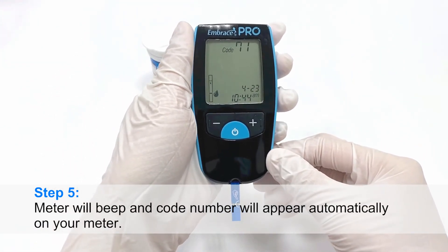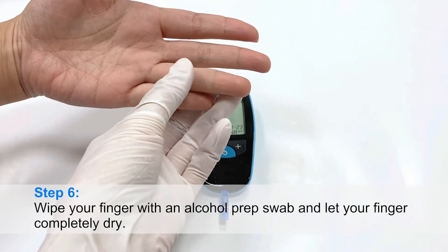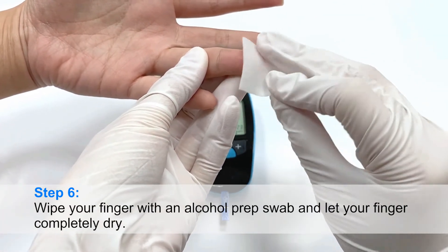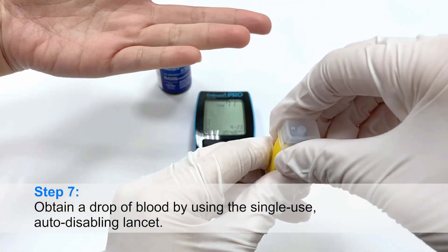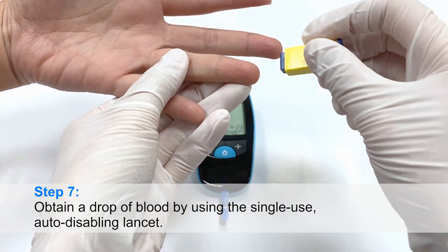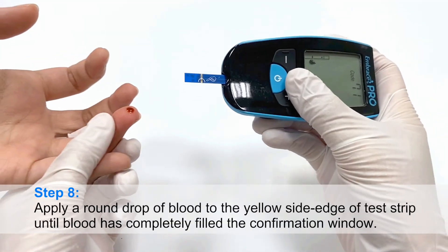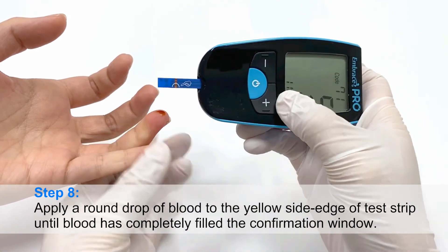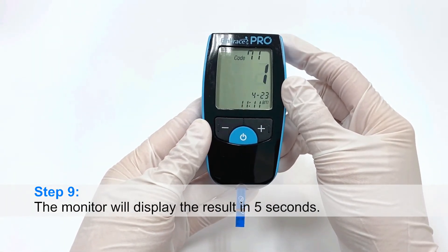Step 5: The meter will beep and the code number will appear automatically. Step 6: Wipe your finger with an alcohol prep swab and let your finger completely dry. Step 7: Obtain a drop of blood by using the single-use auto-disabling lancet. Step 8: Apply a round drop of blood to the yellow side edge of the test strip until blood has completely filled the confirmation window. Step 9: The monitor will display the result in 5 seconds.